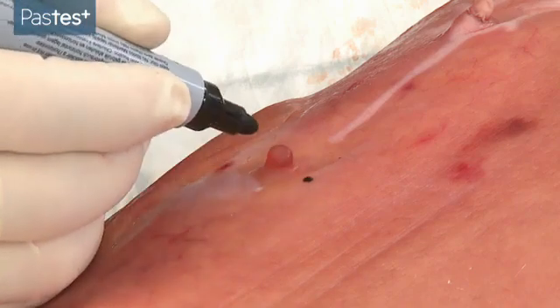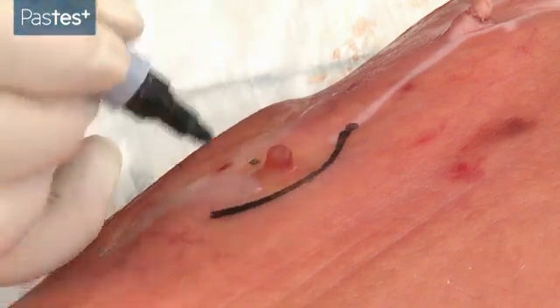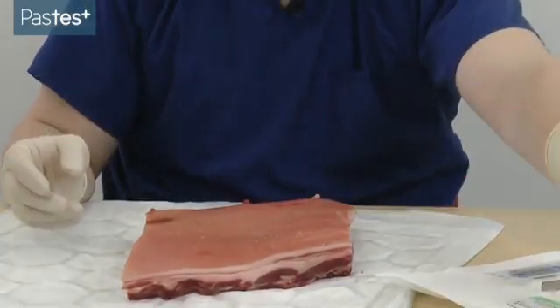Then mark out your incision. It wants to be an elliptical incision, and you need to think about it being 1.5 to 3 times the width. With your appropriately checked and anesthetized patient, you can now prepare your sterile field. Here we're going to use some chlorhexidine prep to clean the area. While that's drying, you can get the rest of your equipment ready.